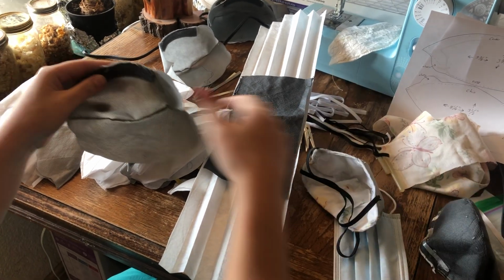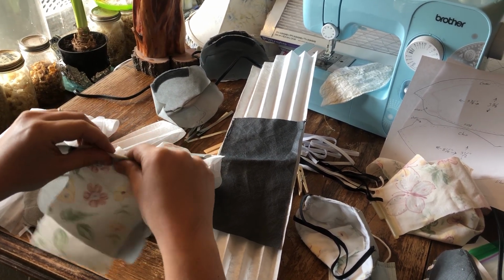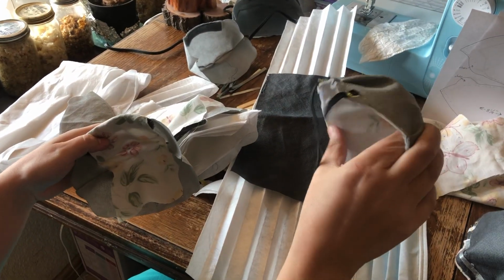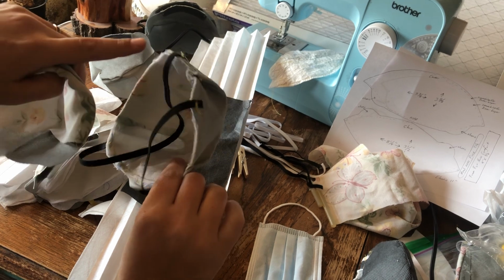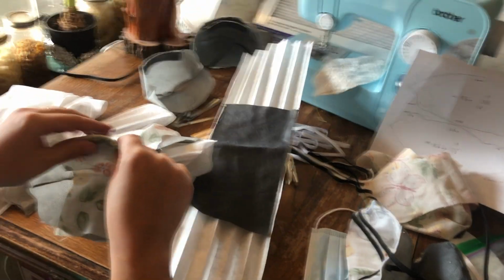So what I did was I decided, well, this old sheet is really soft. I'm just going to sew that, and when I get all done, I flip the sheet in. I tack it in with some hot glue inside, and then it is actually very comfortable. It's not miserable at all. And it's pretty fast and easy. I did not hem the sides. It's like, we got to make a bunch of these. If I spend too much time on each one, they're going to fall apart with a certain amount of use.